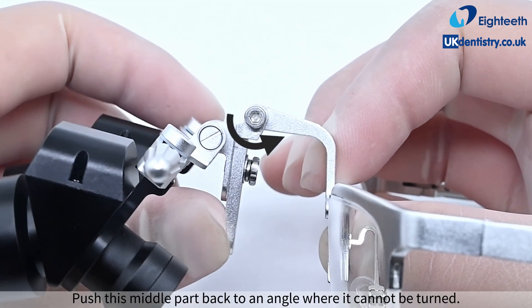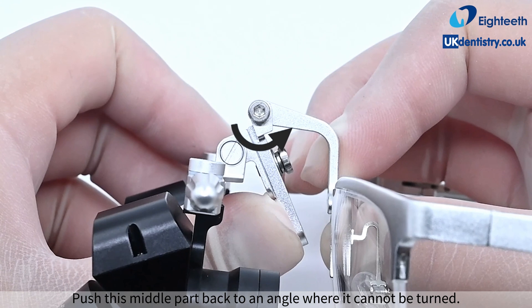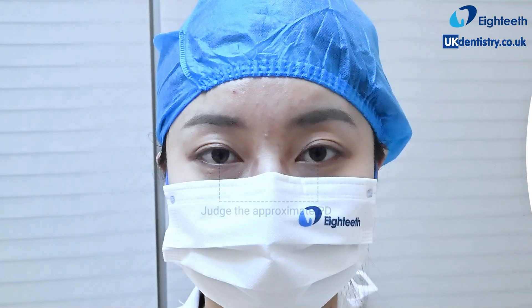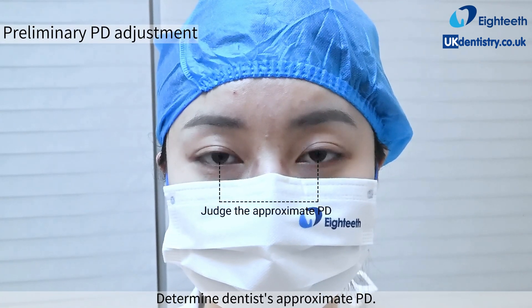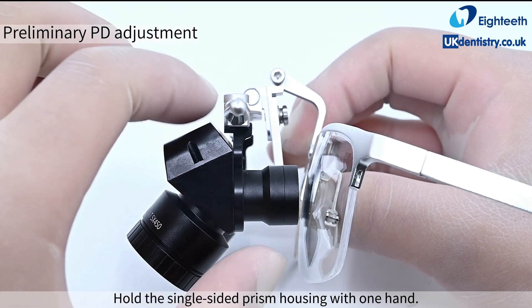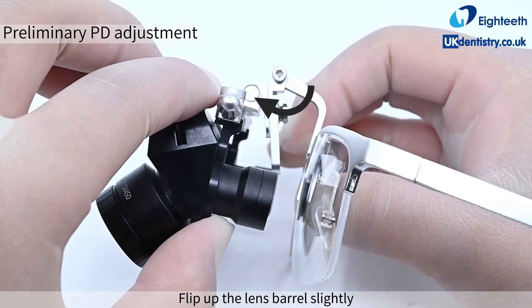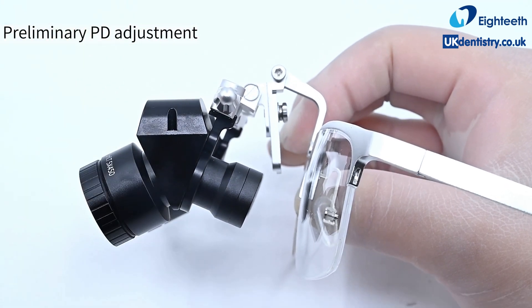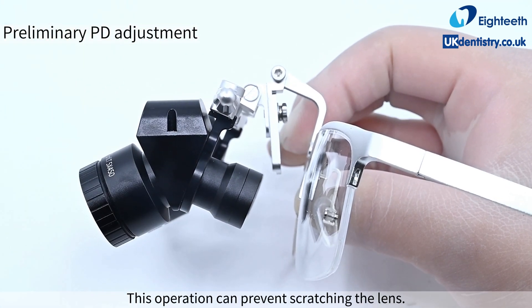Push the middle part back to an angle where it cannot be turned. To determine the dentist's approximate PD, hold the single-sided prism housing with one hand and flip up the lens barrel slightly so that the metal edge of the eyepiece barrel is slightly away from the lens. This operation can prevent scratching the lens.